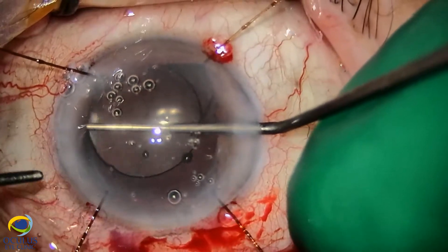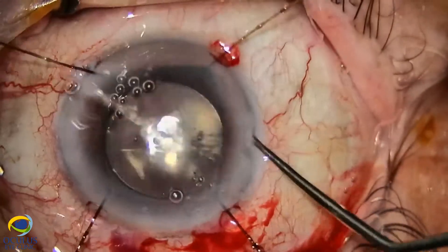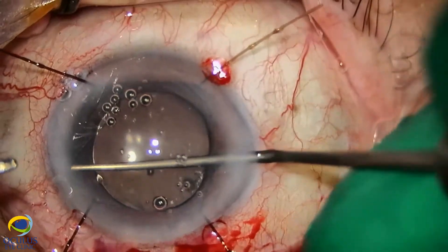If it had been implanted folded, the unfolding force might have jeopardized safe implantation onto this large peripheral capsulorhexis.